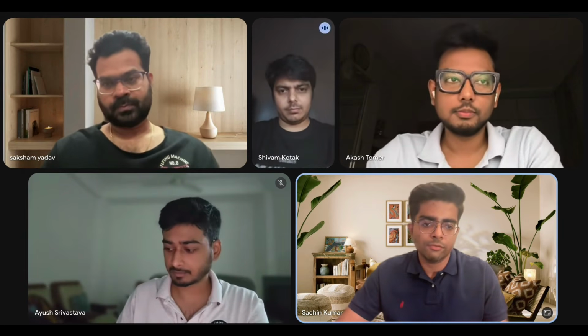So let's just begin. Dr. Tomar, you've already told us what exactly Quillr is. What inspired you to create Quillr? What happened exactly? What was your thought process like?